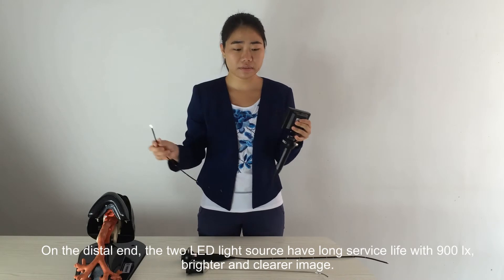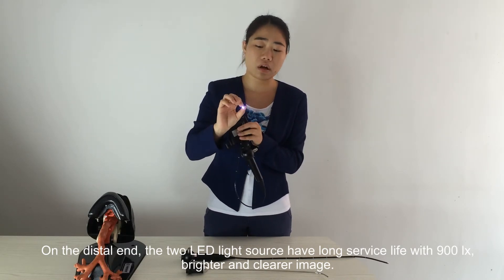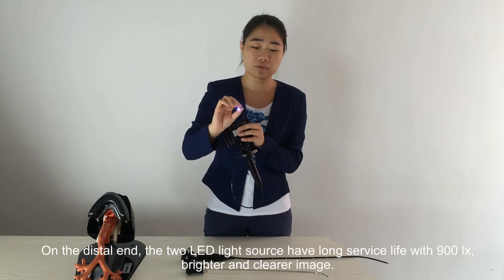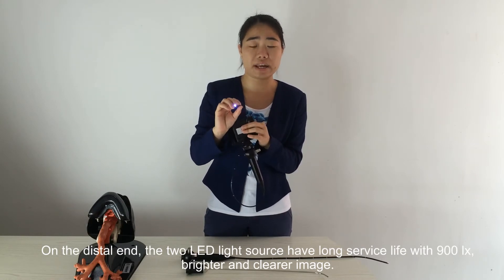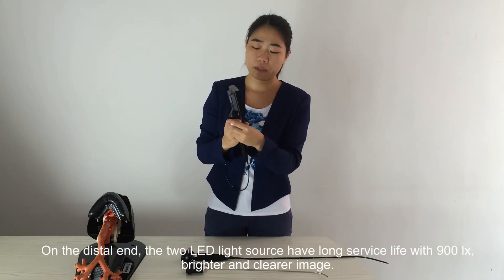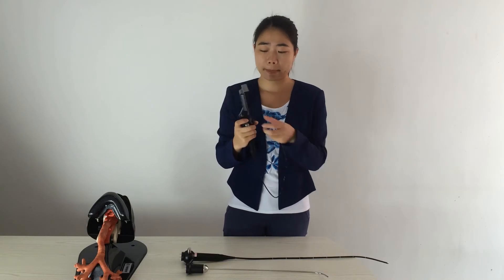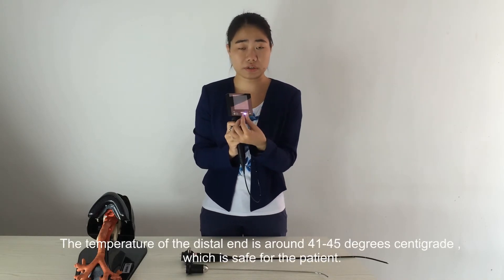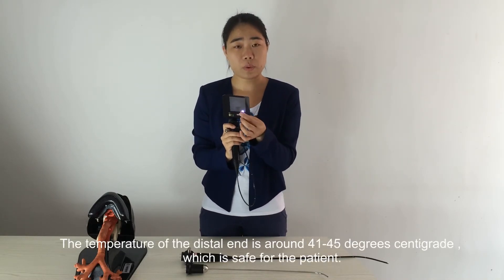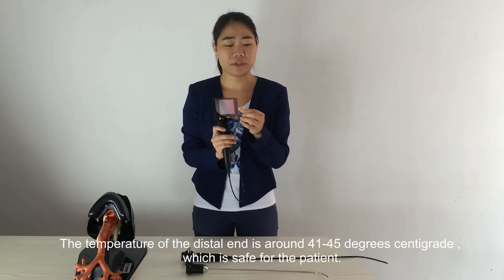On the distal end, the 2 LED light sources have a long service life with 900 lux, enabling a brighter and clearer image. The temperature of the distal end is around 41 to 45 degrees Celsius, which is safe for the patient.